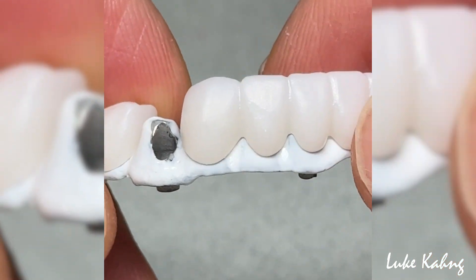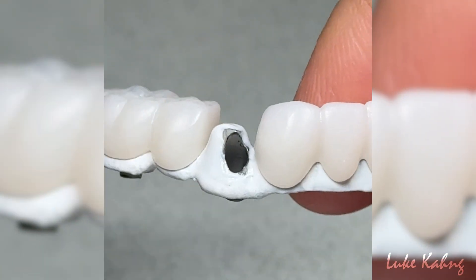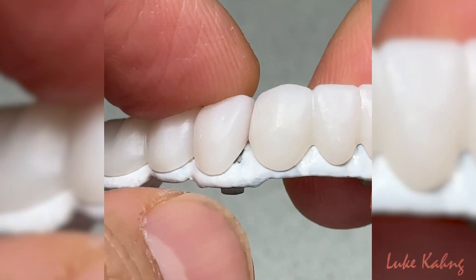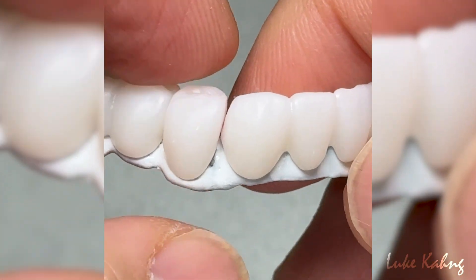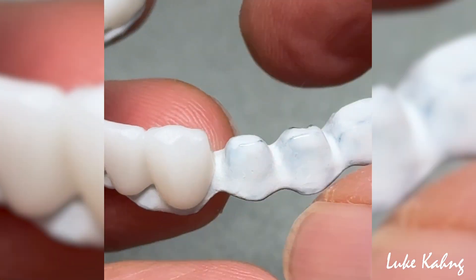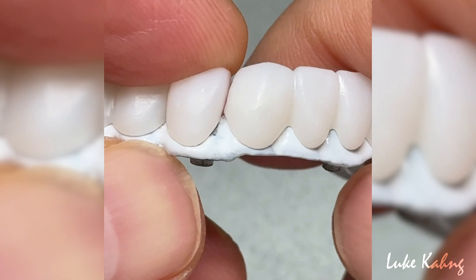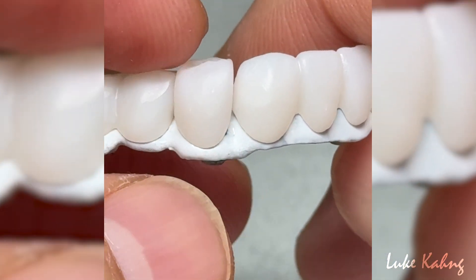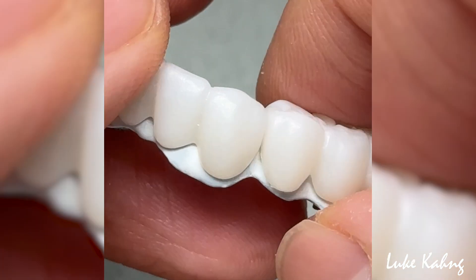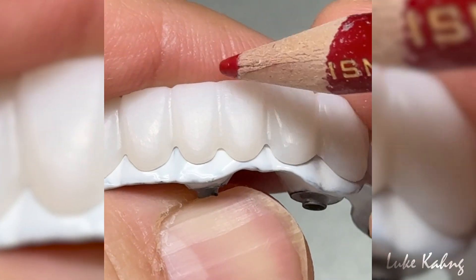After centering it in there, the problem is this — we did not make it a unit; I made a single. The contact is a little bit tight, it's grinding, so we're trying to figure out what we're going to do here — to cut it, make pink porcelain. It's a little bit tricky in this area. Otherwise this one is good. This is the starting point — it's monolithic — I'm going to trim it between the teeth a little bit more deeper for better contour.